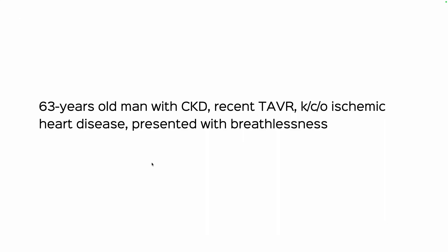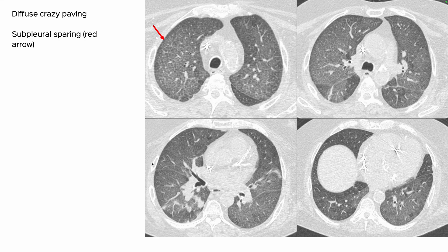This is a 63-year-old man with CKD, recent TAVR, known case of ischemic heart disease, presented with breathlessness. This appearance had been picked up on a CT five days ago. You have septal thickening, you have ground glass — you can see that here very well — and there is subpleural sparing as this red arrow shows.